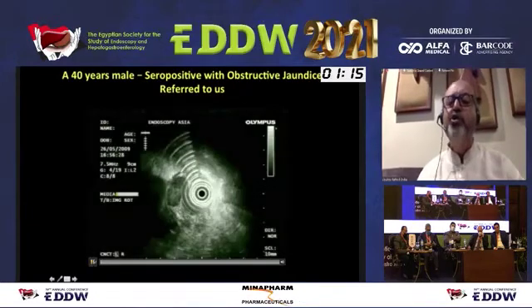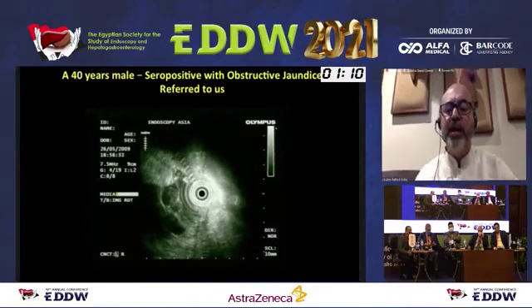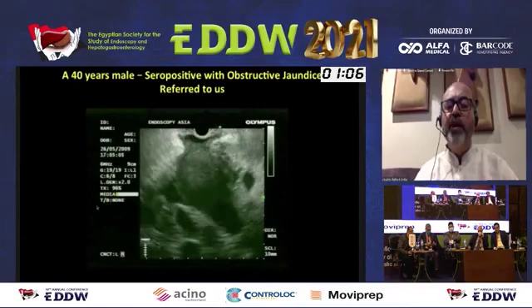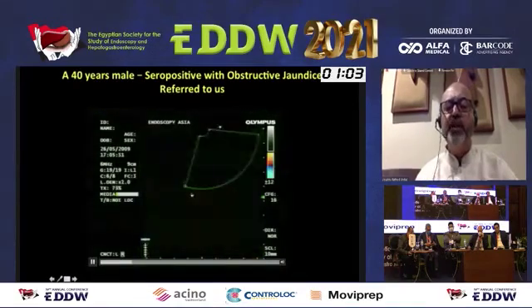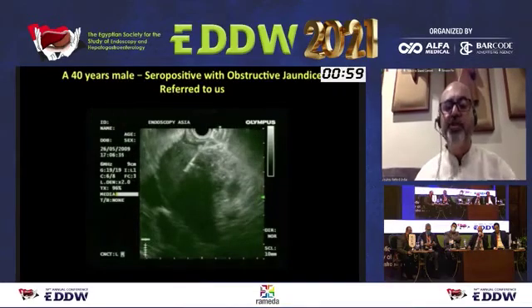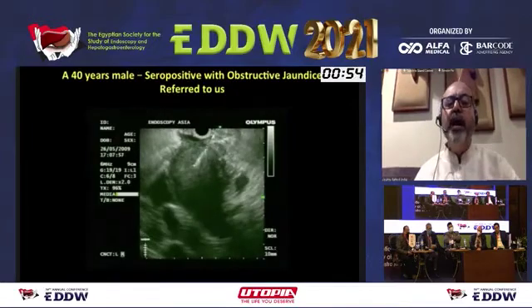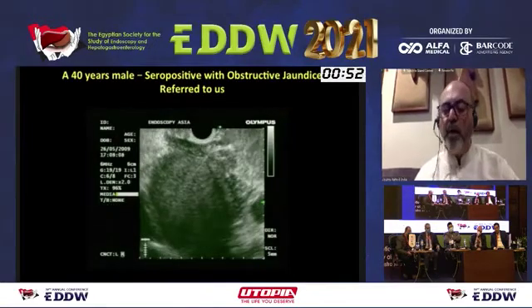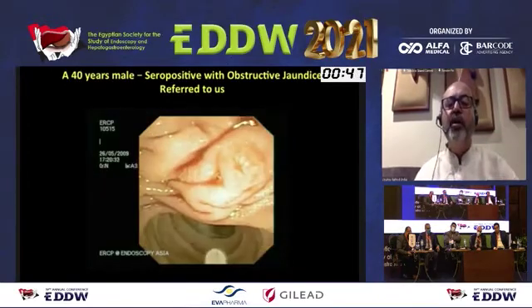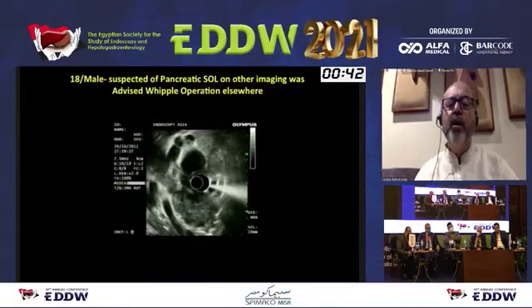Now, there are patients who have seropositive status, lymph nodes, and a mass in the head of the pancreas. I had this kind of a patient more than a decade ago, where the patient had a huge diffuse mass with minimal ascites, and core biopsy at that time was not possible, but we still tried with a true cut needle, which was introduced at that time, and we found that there was a lymphoma of pancreas. And this whole thing changed, and we even took a biopsy from the lymph node, and of course the patient had jaundice, so we needed to treat that as well.